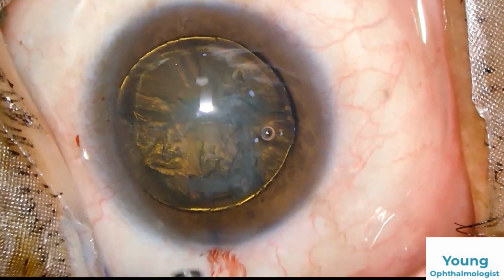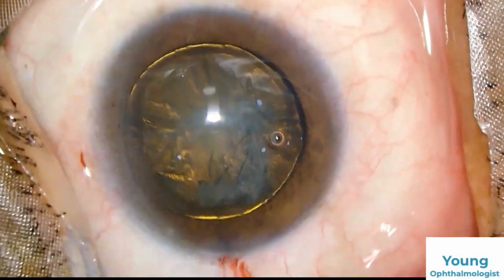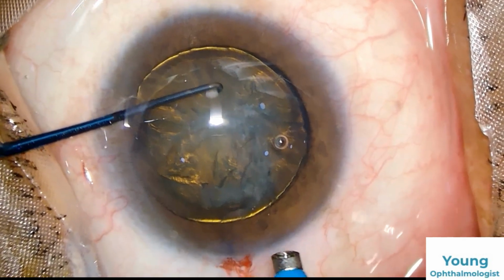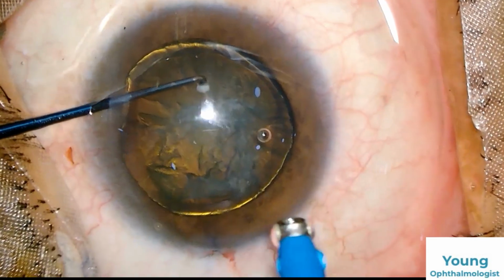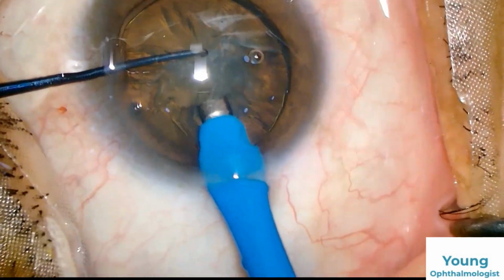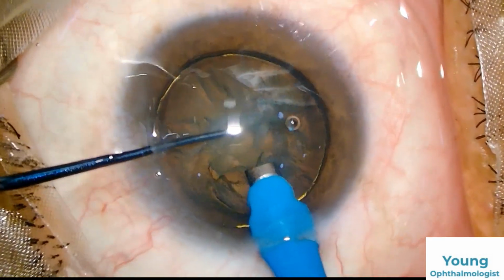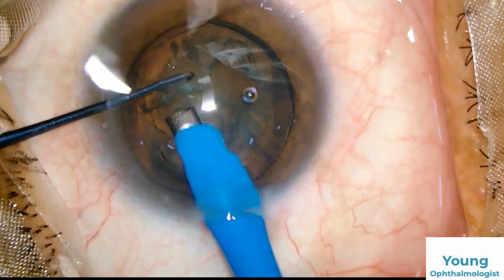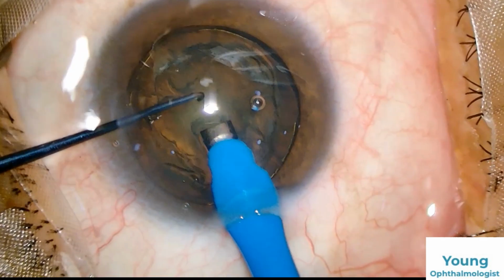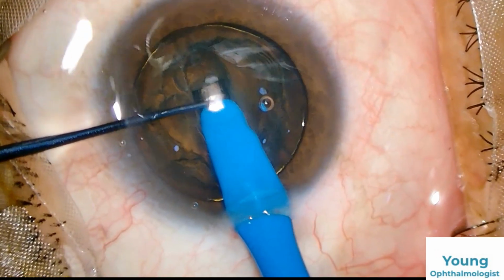Now we will start the phaco procedure. We'll enter into the eye in phaco 1. We have planned stop and chop. This cataract is a little bit soft. Here my settings are vacuum 80, power is 50 and flow rate is 25. You don't need too much vacuum at this step and not too much flow rate.